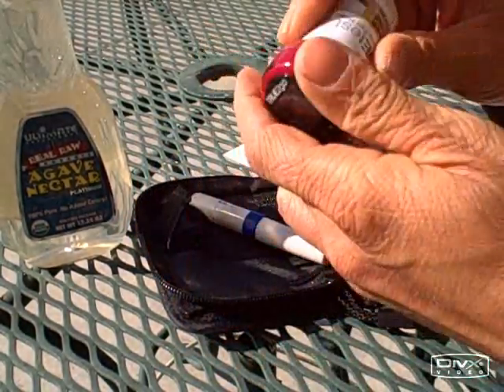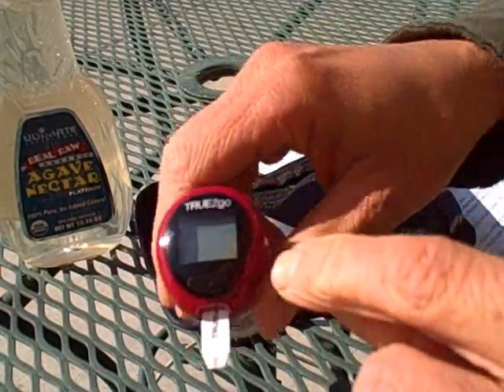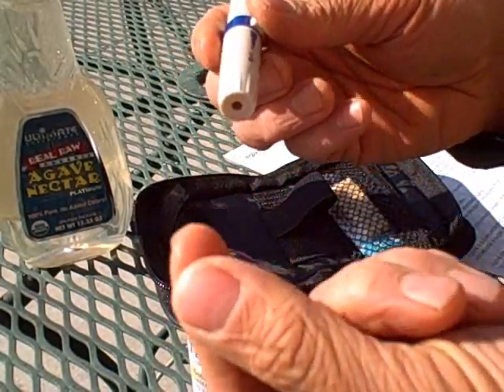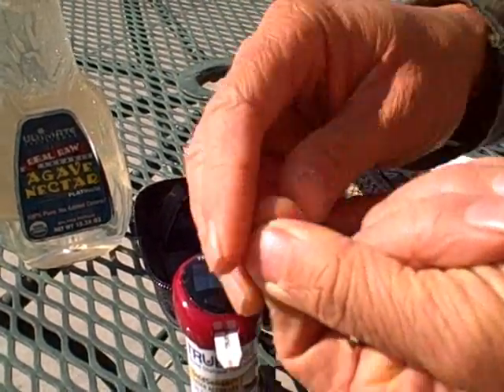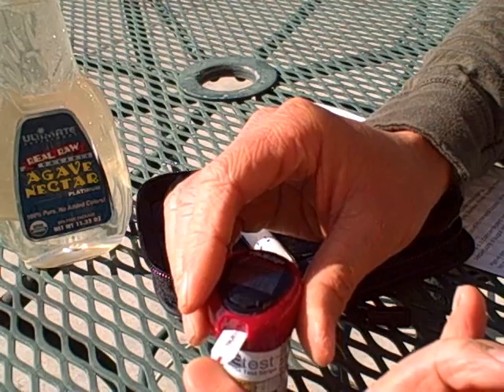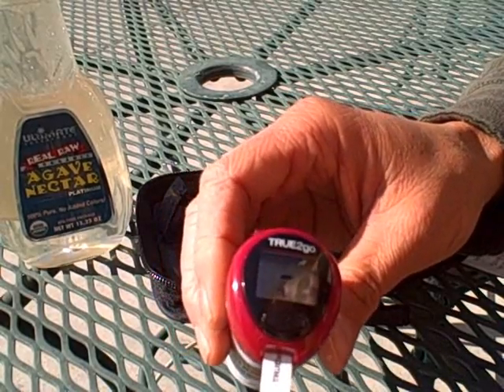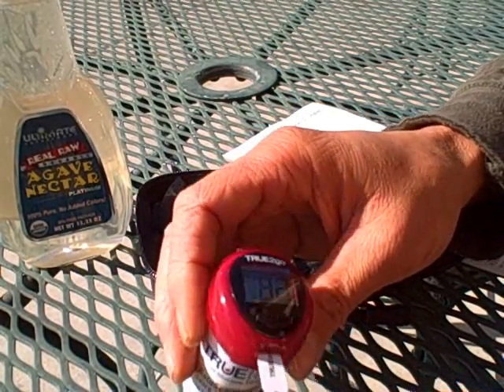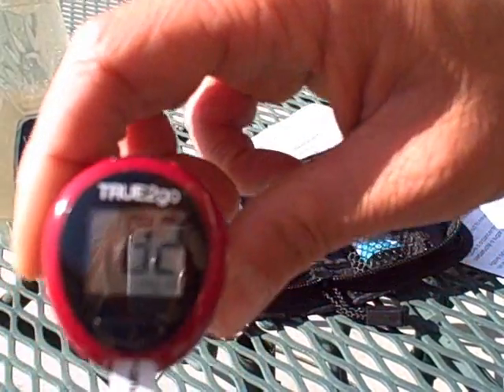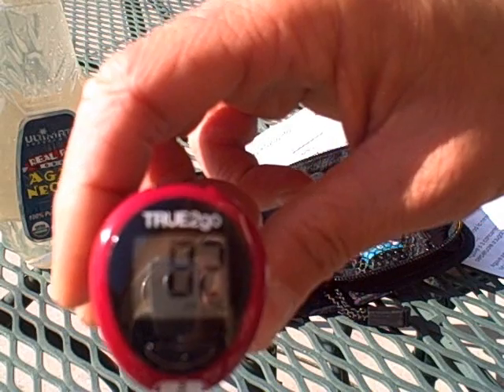The meter comes on, flashing for blood. So now I've got to get some blood — we've got a little lancet device. This is all in the name of science. Okay, ready — oh, that hurt. Now we put it on the strip. It's working — thank God that was enough blood. My fasting blood sugar, as you can see on the meter, says 82. So 82 is my fasting blood sugar, and now you're going to see me eat the agave and then we'll do another test.